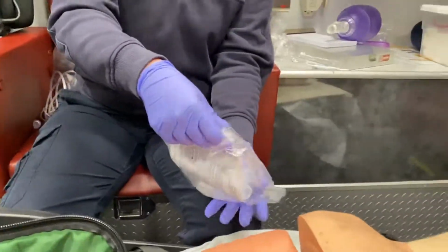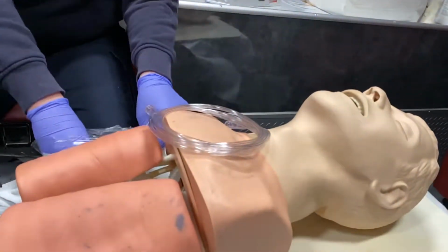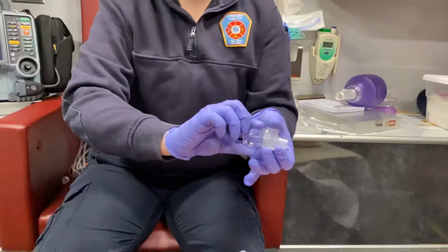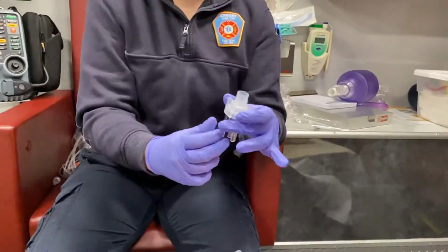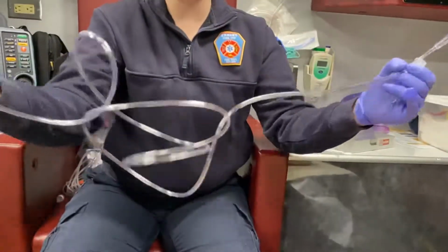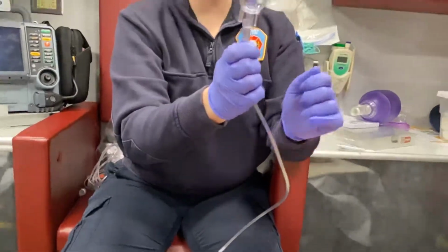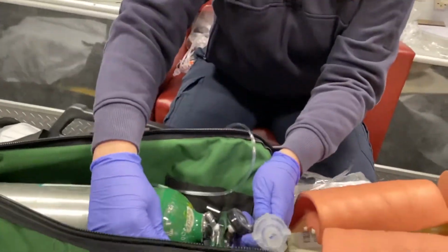So the first thing I do is I tear open the top of the bag. You want to make sure that you're not dropping everything as it comes out. This is the reservoir. It does come apart, but this is where your medication's going to be going. I usually leave it attached, and I just put my medication down the top when I'm ready for that. Your tubing, this is your oxygen tubing that's going to connect to your tank. So one end is going to go on the nebulizer piece where your medication goes in, and the other is going to connect to your oxygen regulator.